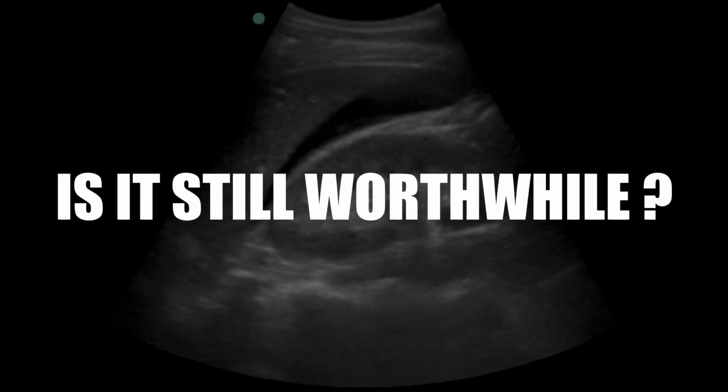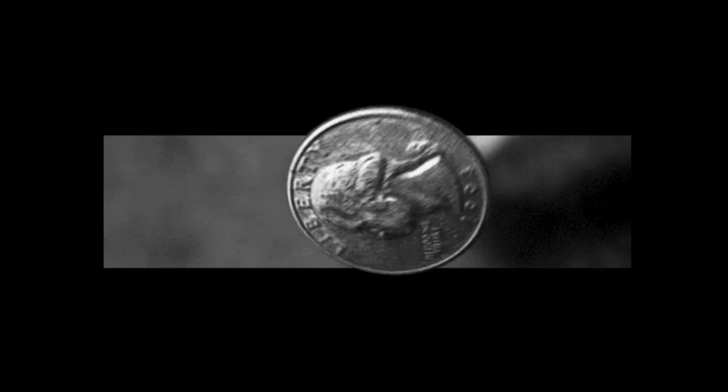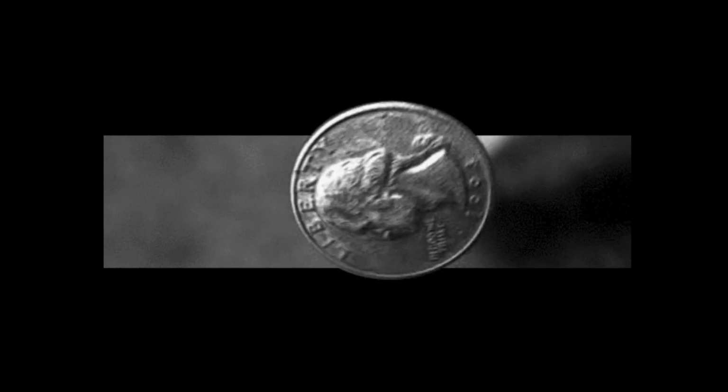So, if we go back to the beginning and ask ourselves, is the FAST scan a worthwhile modality in our stable patients with blunt trauma? Well, firstly, if you're trying to exclude an intra-abdominal injury in a stable patient by using a negative FAST scan, well, your clinical judgment would be more accurate if you were to flip a coin.